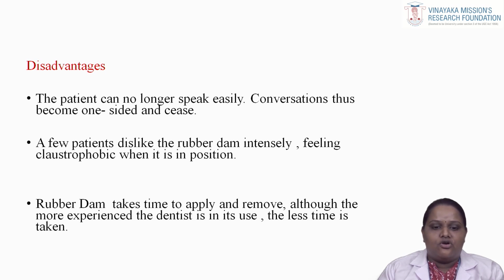The patient can no longer speak easily once the rubber dam is placed. Conversations thus become one-sided and cease. A few patients dislike the rubber dam intensely, feeling claustrophobic when it is in position. Rubber dam takes time to apply and remove, although the more experienced the dentist is in its use, the less time is taken for the procedure.